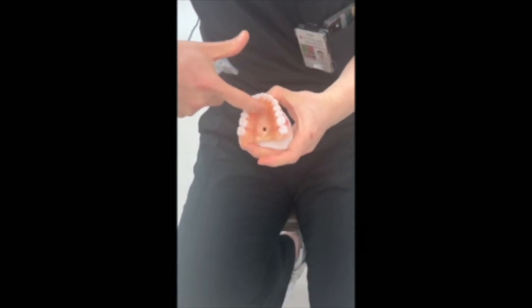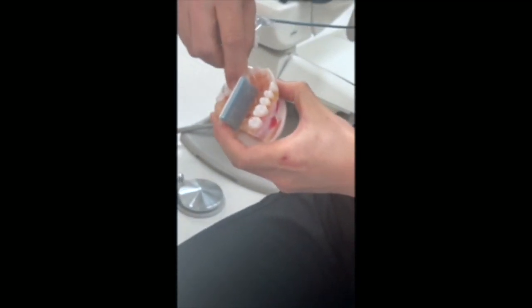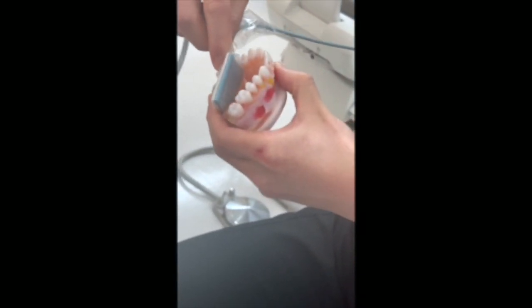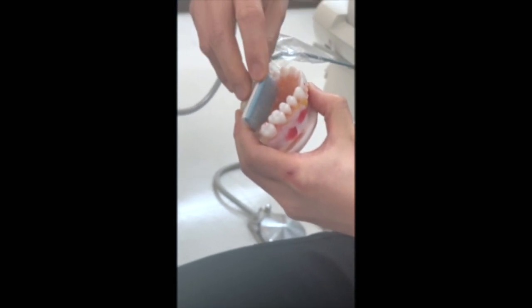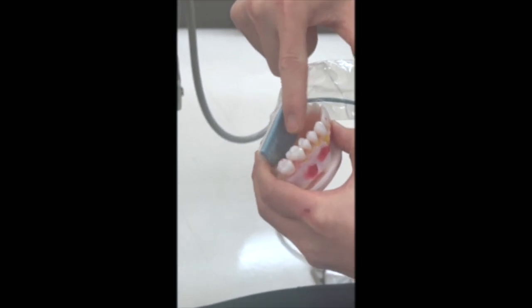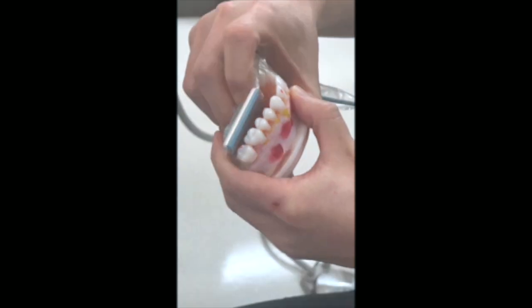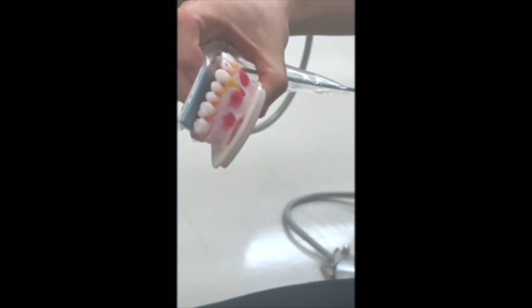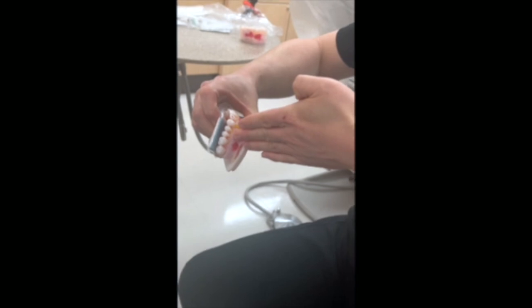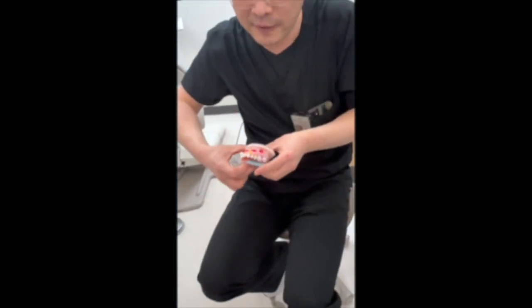Again, we have to use the palatal space. So we can place it into the palate and then rotate it to achieve a bisecting angle radiograph. And then we can angle it, a vertical angulation, and then have the X-ray tube directly angled towards the center. By doing that, your premolar will be in the center.